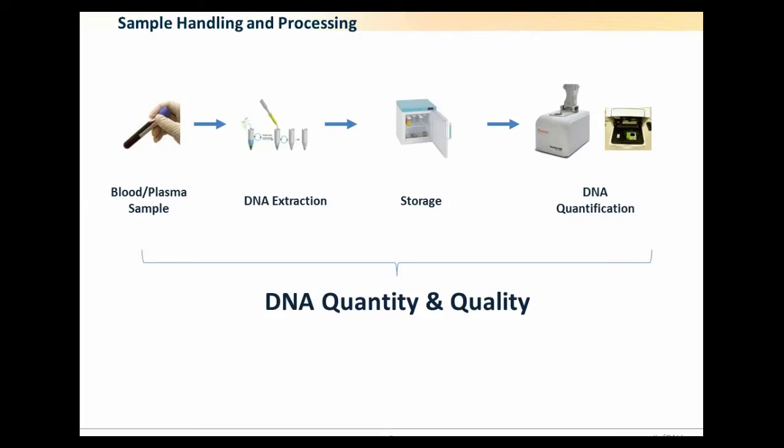On the next couple of slides, I've broken apart the workflow into two parts. The first part is pre-analytical, and this is very much where you'd be handling or processing your sample. So you're taking your blood or maybe your urine, you go through your DNA extraction step. You may have to transport your sample, which could be either pre or post extraction.